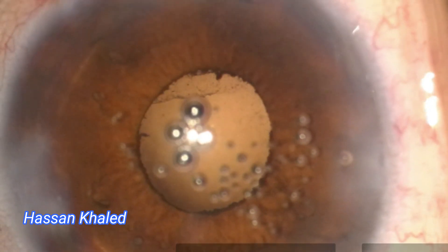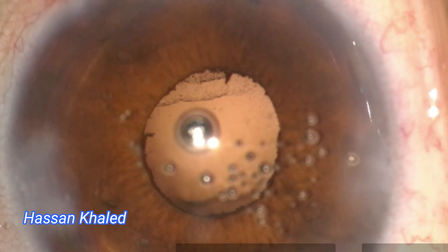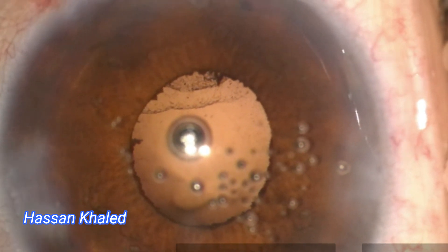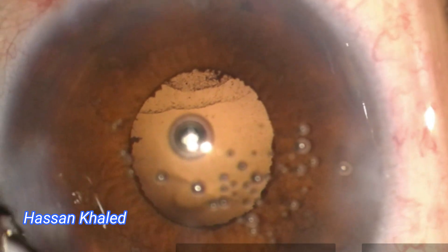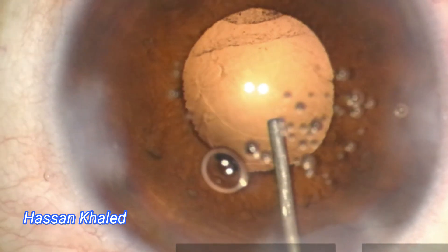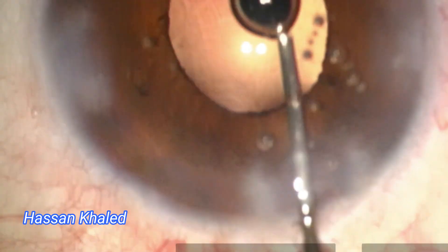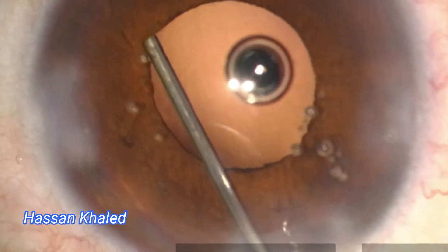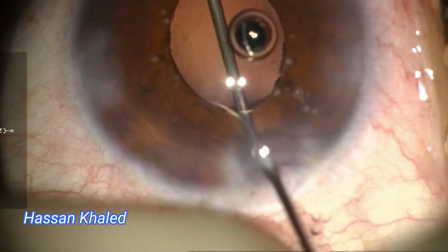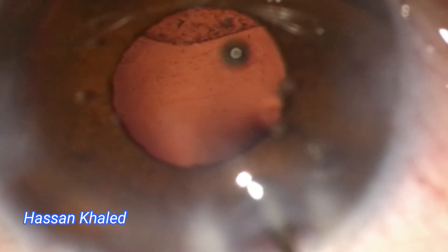Now look at the posterior capsular folds or wrinkles, which are signs for both zonular weakness or peripheral/equatorial posterior capsular tear. I inject intracameral mydriatic agent — unfortunately the small pupil does not respond. I put viscoelastic and try to check if there is any peripheral tear, but I couldn't see.